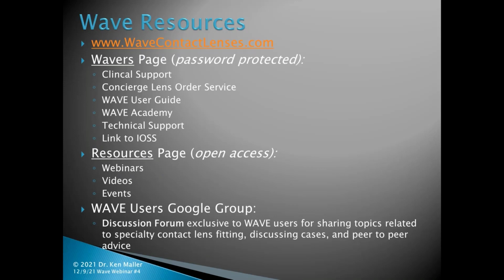Sure. All right. I have two final questions for you. We'll get through them very quickly. Go ahead. The first is, at the very beginning, you mentioned fit and vision can be mutually exclusive, for example, in that final case where you have a more complicated cornea. How do you prioritize between fit and optics?